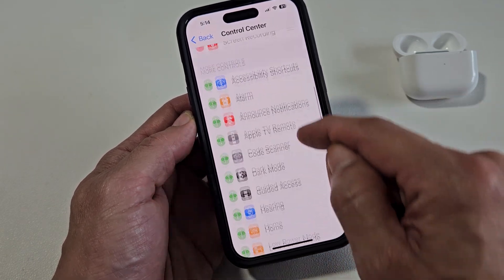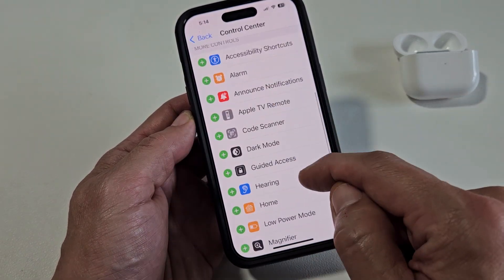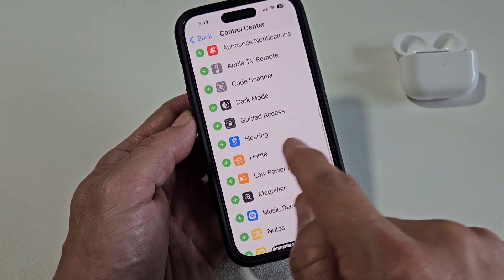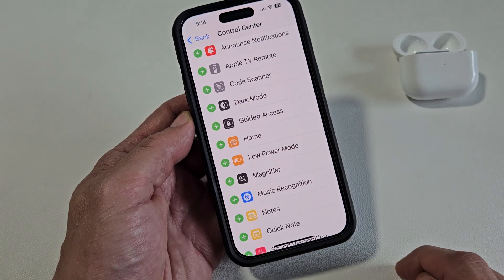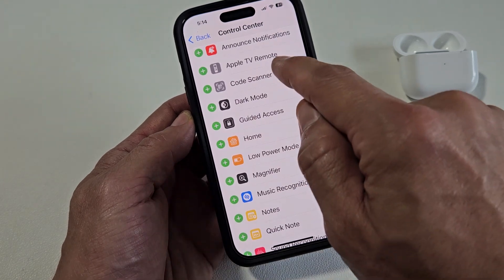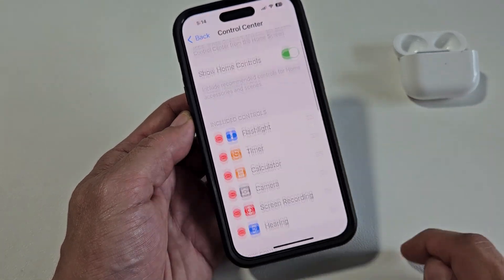So now you just want to look for Hearing. Scroll down, look for Hearing. Hearing's right there. There's a plus right there — just tap on the plus sign.